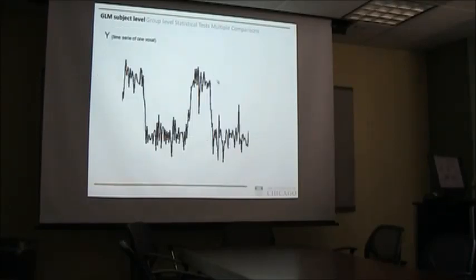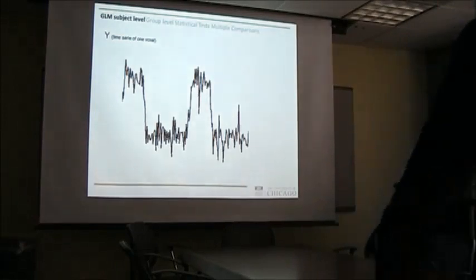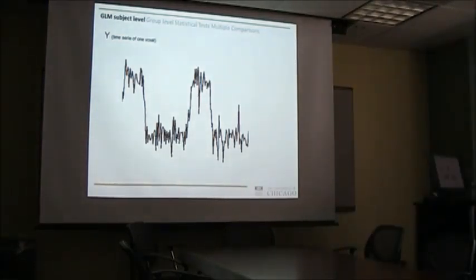So what you're then trying to do is, suppose you have this time series from a voxel. That means the response over time in a certain voxel, say the amygdala, our favorite brain region. It might look something like this. It's always quite noisy, so you have a lot of peaks going on, but you might also see somewhat of a response here already. That's a super beautiful, nice voxel. This is a little bit of an ideal voxel. I added a little bit of noise. You can find them. But this might be the response of one voxel during this experiment.